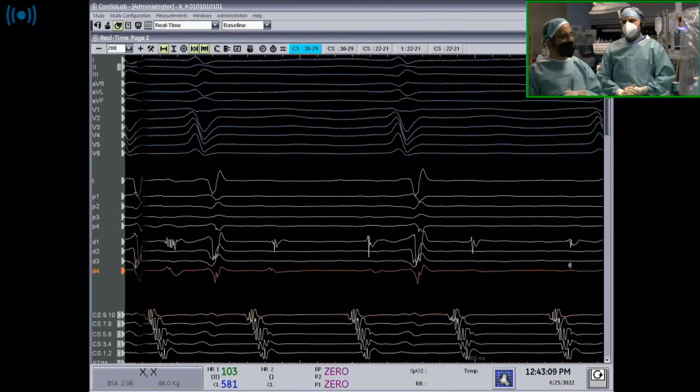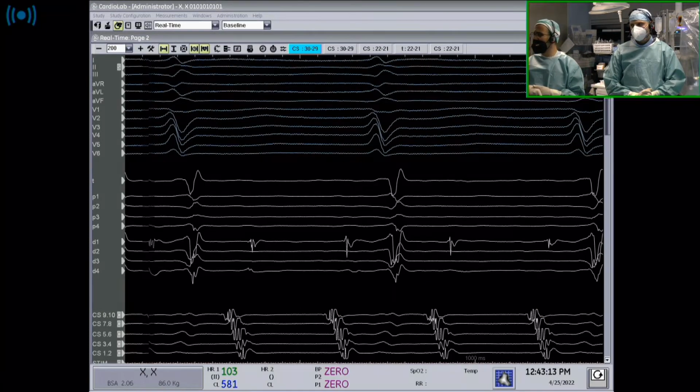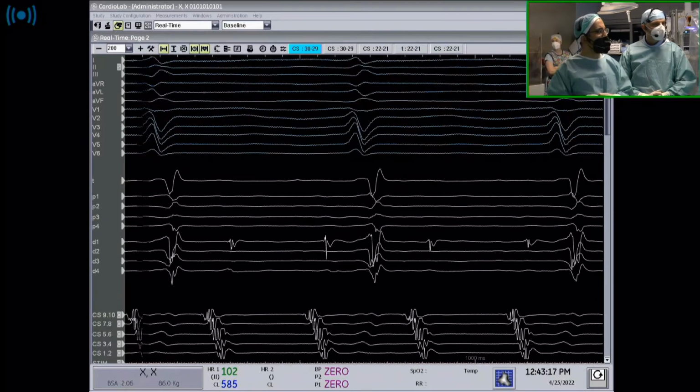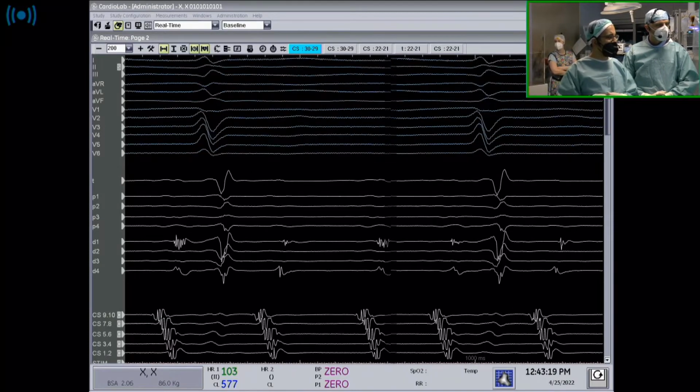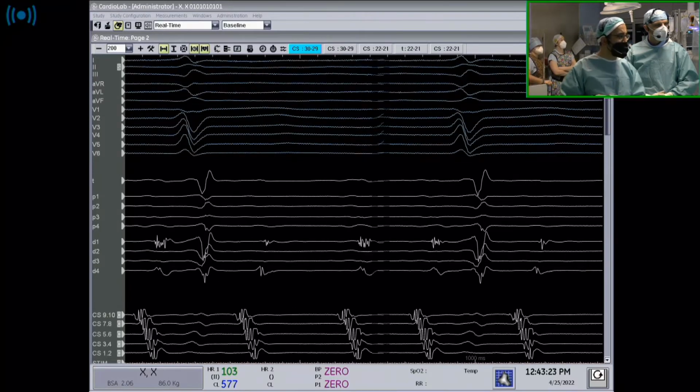So you can see the tachycardia. I think the cycle length is just shy of 300. Is that right? Yeah, 285. We started by mapping the left atrium. Let's see the activation of the left atrium of this tachycardia. You can see this on the left.